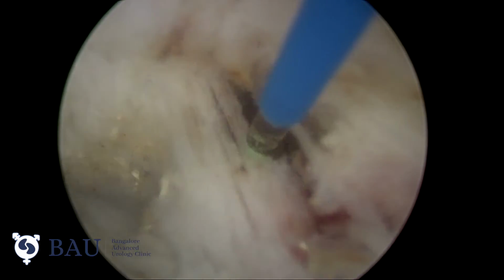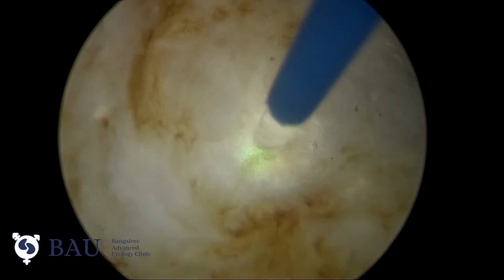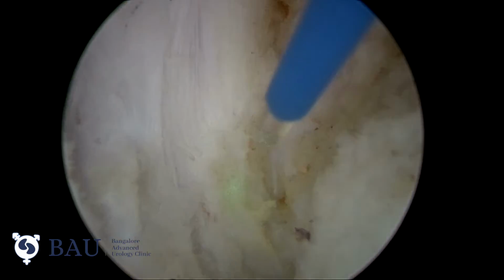We are almost reaching the vertical fibers of the bladder neck.